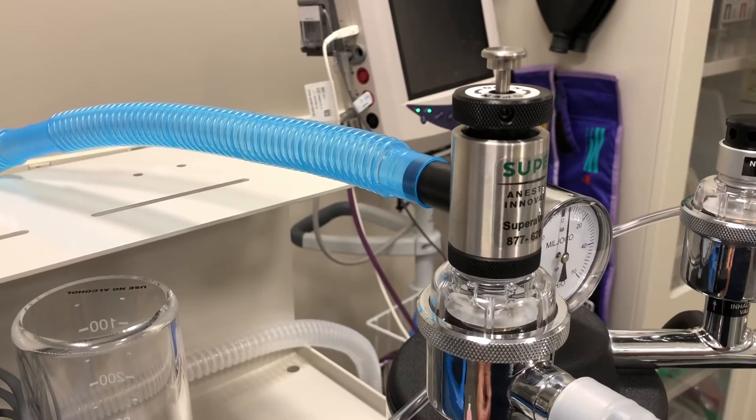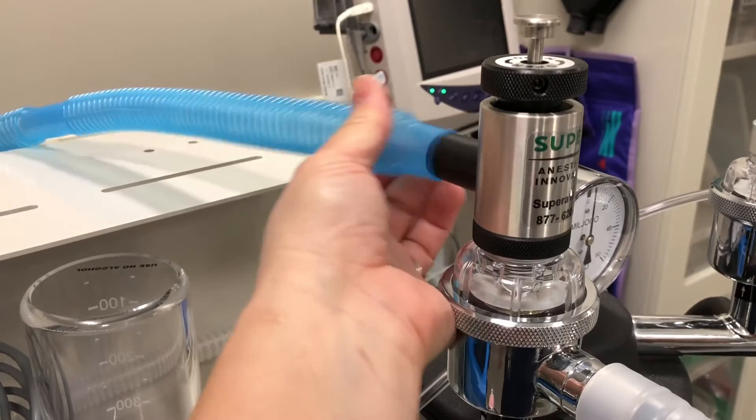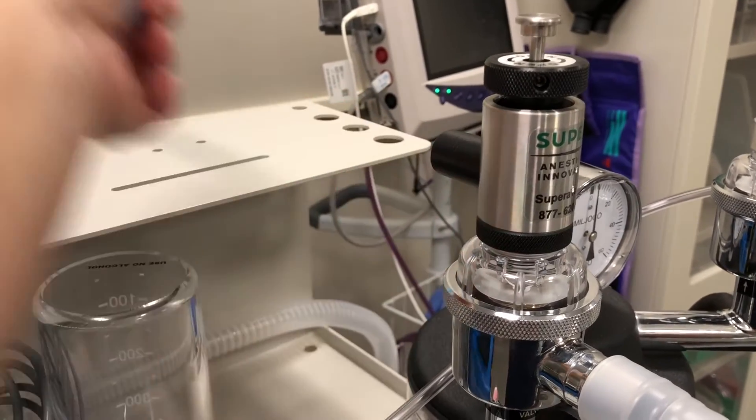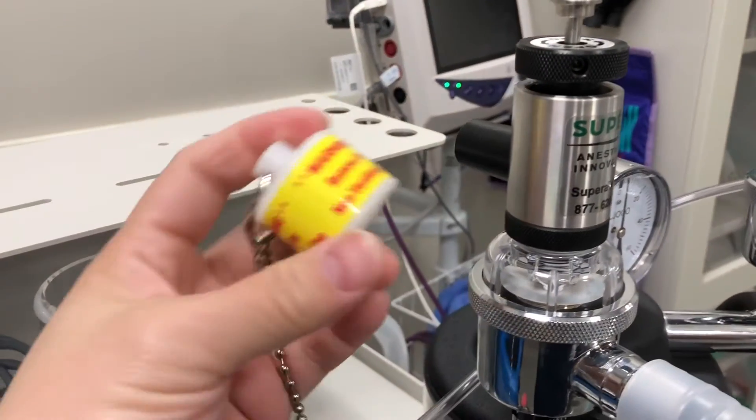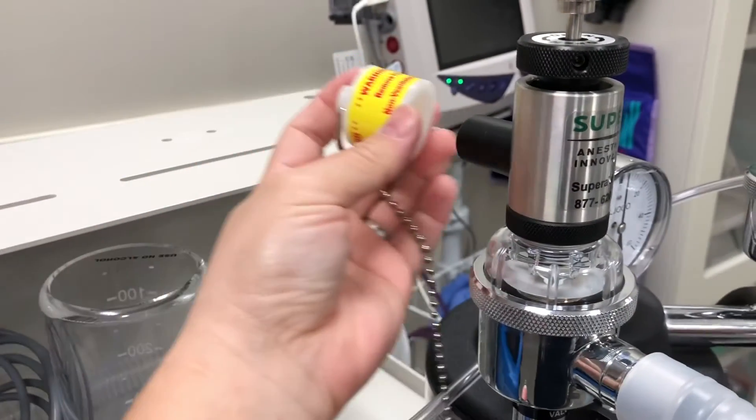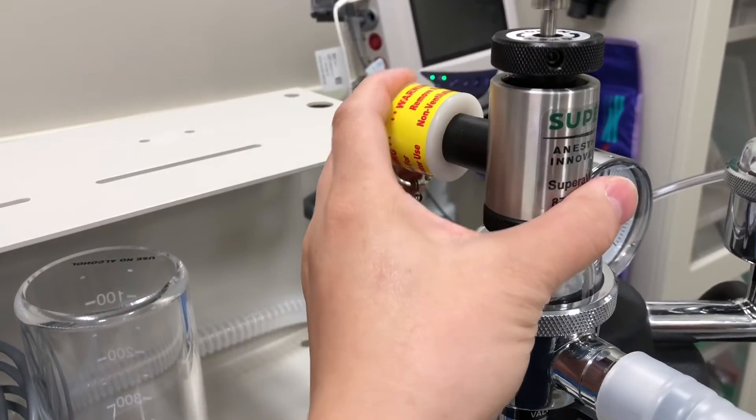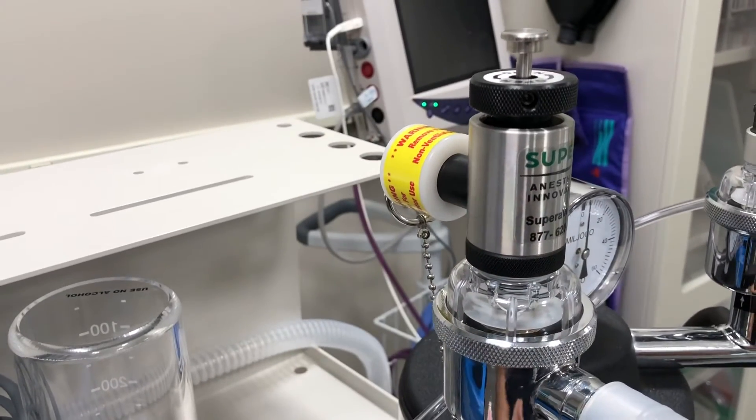To close the pop-off for ventilator use, remove the scavenge tubing from the back of the Supira valve and place to the back of the ventilator like normal. Take your occlusion cap and place it on the back of the Supira valve. That's going to close your pop-off.